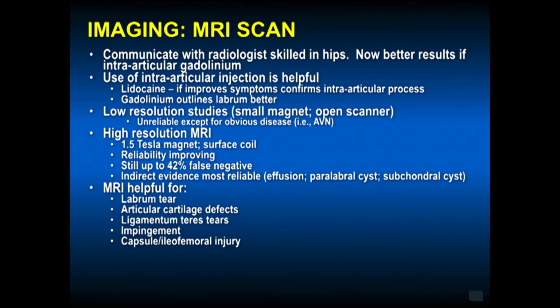If you're doing hip MRs, this radiologist should be skilled in hips. Now there are better results if we use intra-articular gadolinium. The lidocaine confirms an intra-articular process of the hip. The gadolinium outlines the labrum better, so you can do both intra-articular injections with lidocaine and gadolinium.